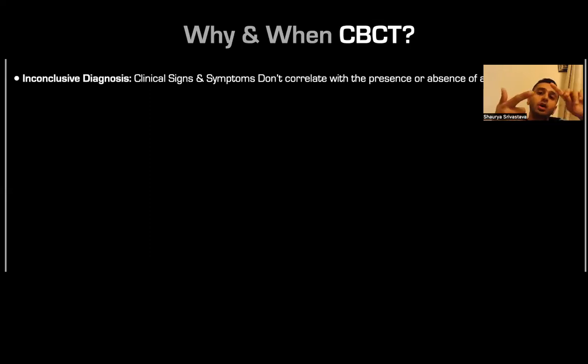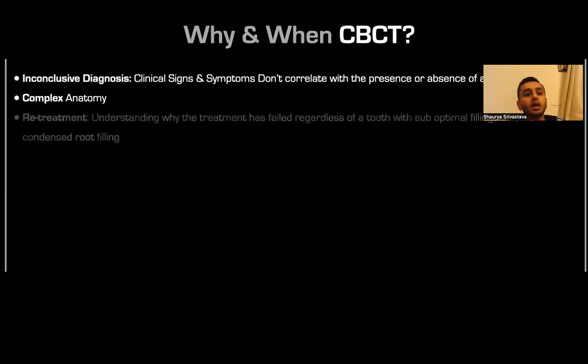If you do not have your clinical testing right, if you do not interpret 2D radiology correctly, the use of CBCT is not redundant, but you will not pick up what you want to know. Then we have complex anatomy, because you have superimposition due to the roots and the angulation of the x-rays, which is of course a limitation as well.